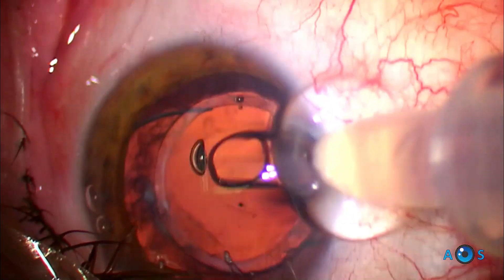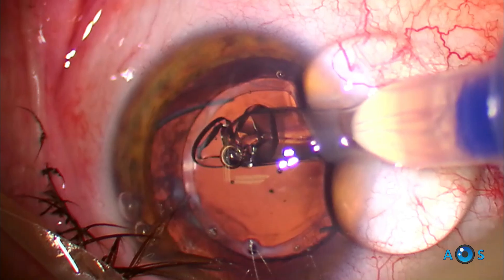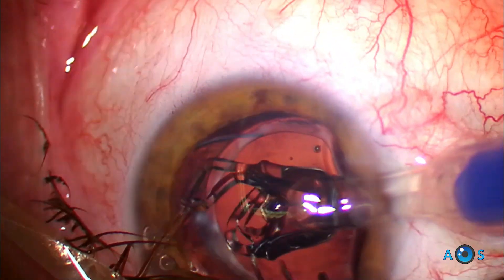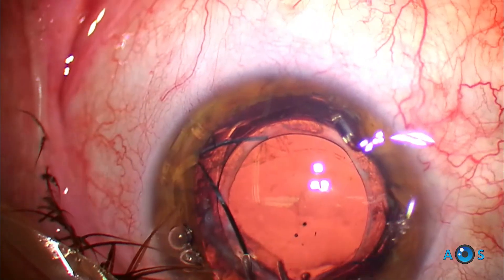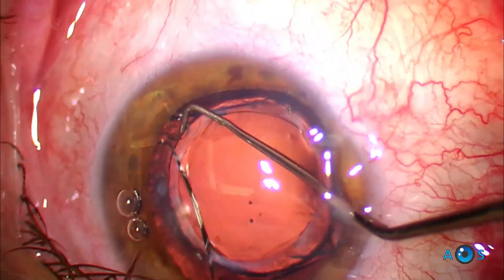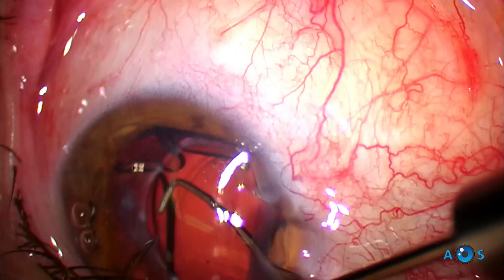The lens is then implanted and quickly unfolds. Notice that it has four square-shaped haptics, and these will be tucked in the ciliary sulcus. The best strategy is to slowly rotate the lens so that the haptics will sequentially slide into the sulcus.